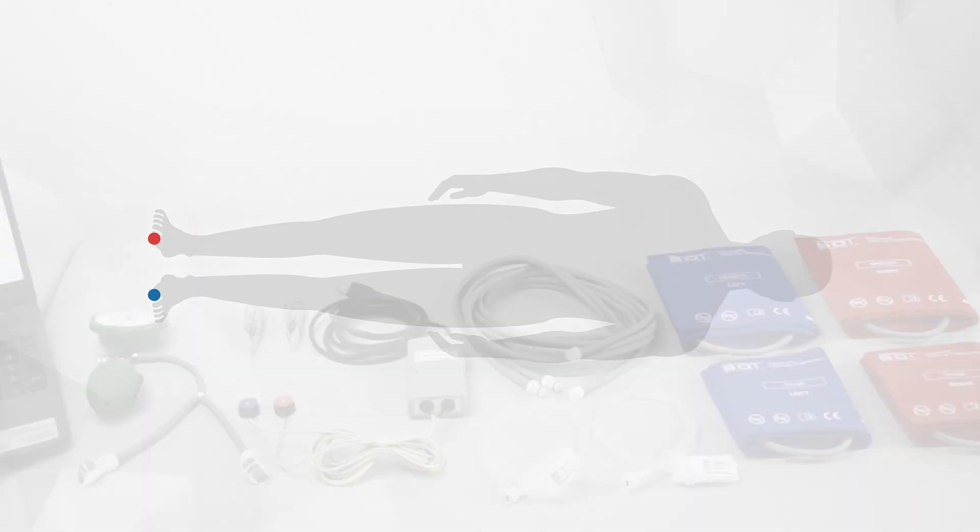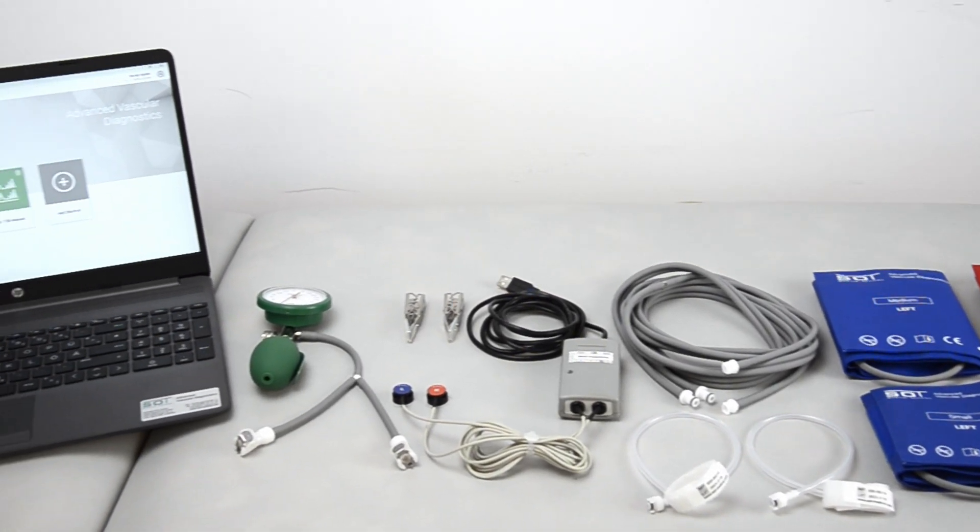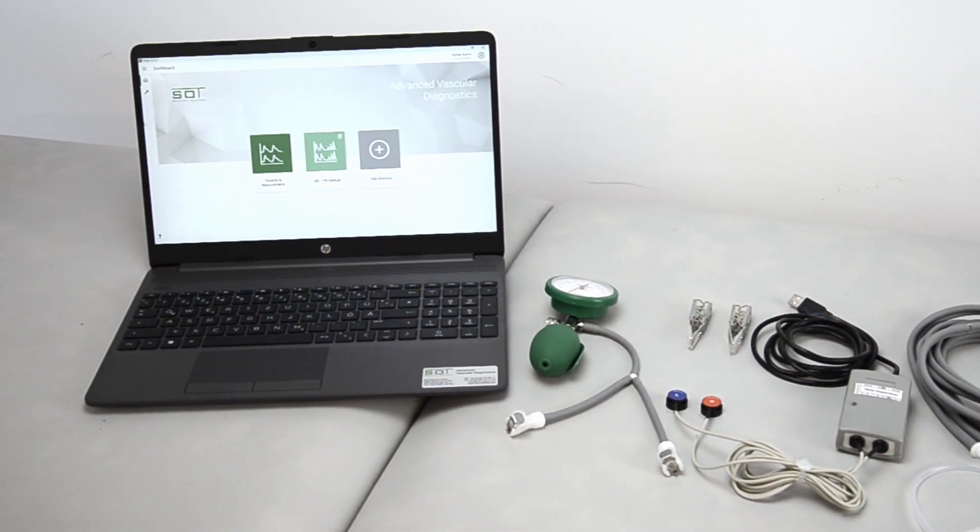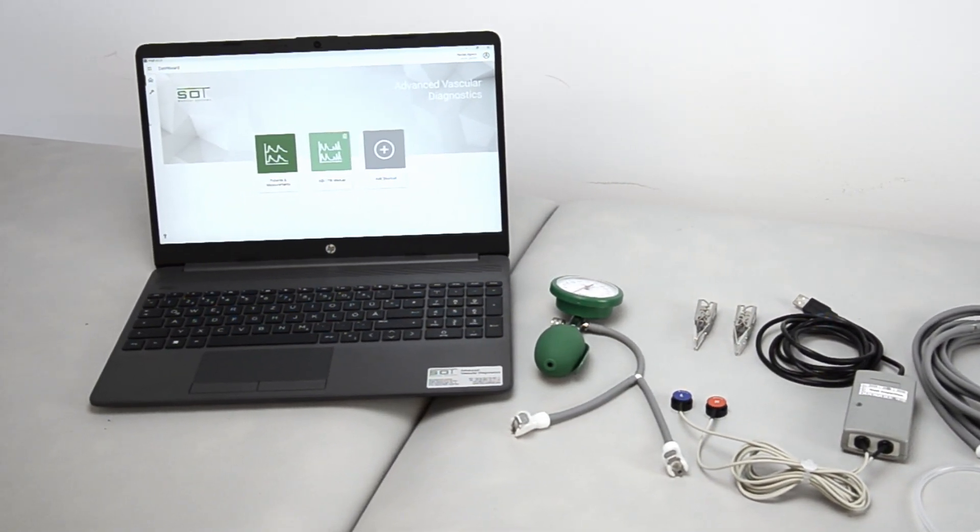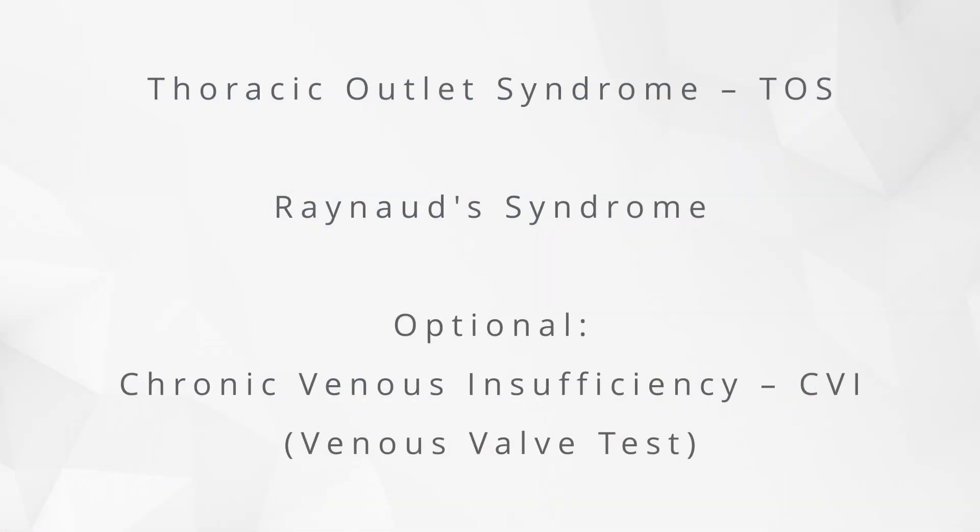The system comes with a two-channel PPG system with optical sensors, cuffs in different sizes to cover fingers, toes, ankle and upper arm, and the hand pump with a manometer. In addition, the system supports thoracic outlet syndrome tests, Raynaud syndrome tests or optionally chronic venous insufficiency tests.